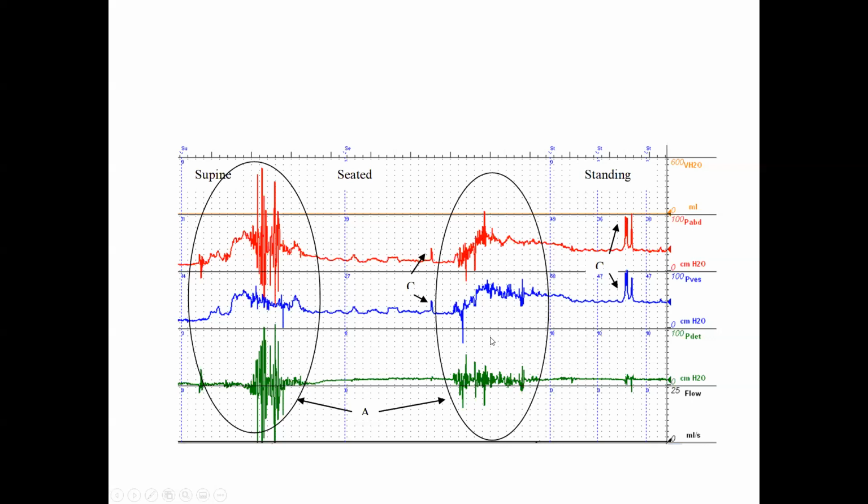What I am suggesting might be useful is that between each movement of your patient, so into different positions, that you perform some form of quality check. So in this case, a cough test, just to make sure that lines haven't become dislodged at any point during the test, or that you haven't trapped them under something in the process of you moving this patient.